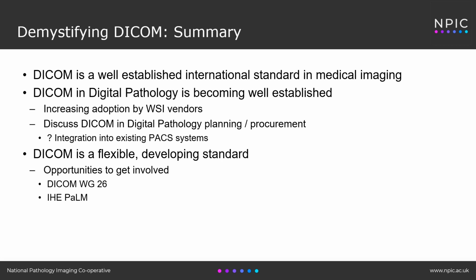And if there's one takeaway message from today's presentation, it would be just to think about DICOM, and really particularly if you're planning or procuring any digital pathology solution, please just discuss it and think about the future, and ask any potential vendors about their existing and future plans for DICOM implementation, because it's going to become increasingly important, particularly within the NHS, we're hoping in coming years.